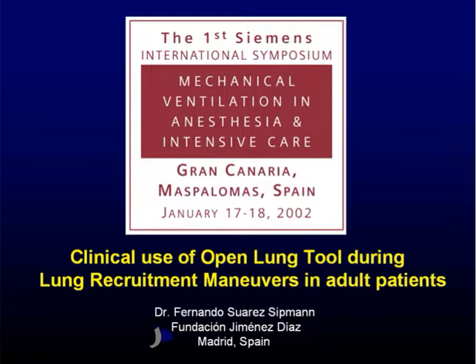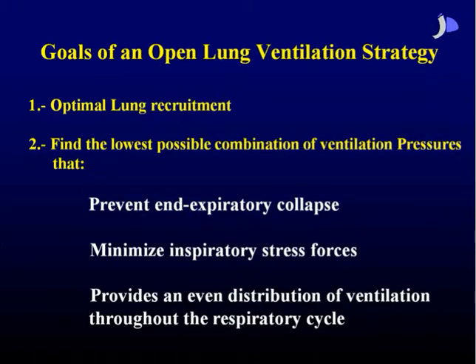And the second focus on this evaluation, and for me the most important one, was to see if lung mechanics by itself, apart from oxygenation, could give enough information to help guide a bedside clinician through the complex process of an open lung ventilation strategy. So I would first like to start my presentation reminding the audience about the goals of an open lung ventilation strategy.